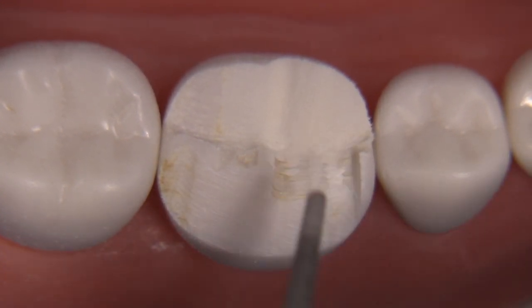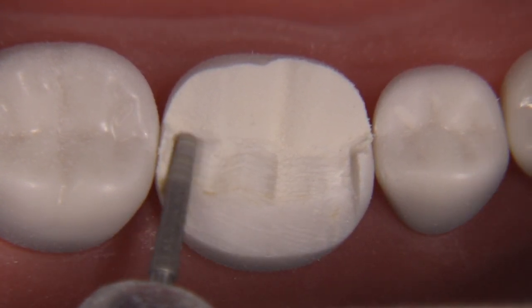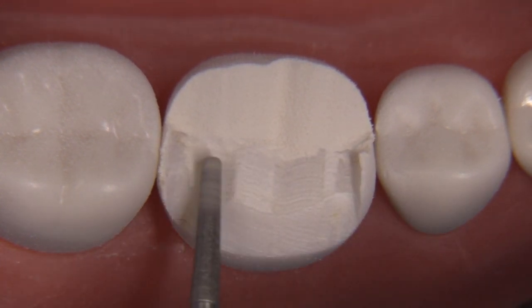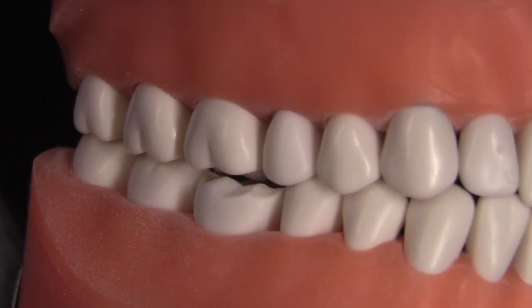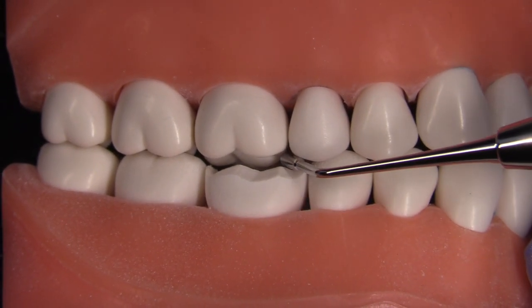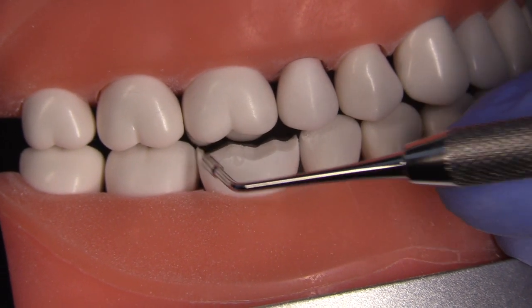After finishing the C plane and A plane we can now turn our attention to the B plane, which is quite easy because most of it is already gone at this point — the upper portion anyway — by doing the A plane. We just follow the rise and fall of the triangular ridges including the distal cusp. You can verify that you have 1.5 millimeters of clearance. Using the RGS4, we know it's 1.5 millimeters wide, so we can slip it in and confirm at least 1.5 millimeters of clearance from incline to incline.